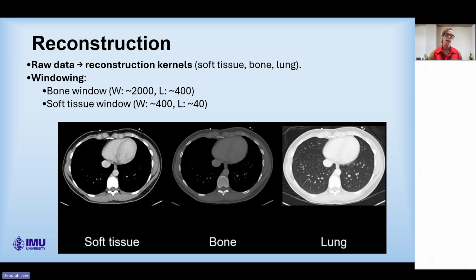So if someone's had a big injury to the abdomen, there's a lot of blood in the abdomen, and we're looking for bleeding sources, CT scan is incredibly good. It's also very, very good at looking at the lungs and the chest. So things like cancers, particularly small cancers in the chest and the mediastinum, are very well seen with CT scan.